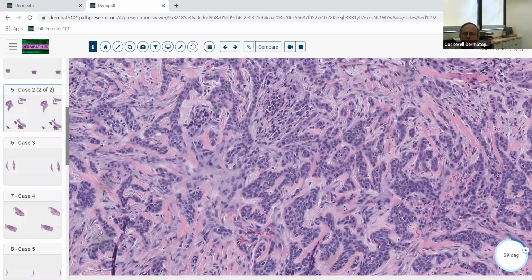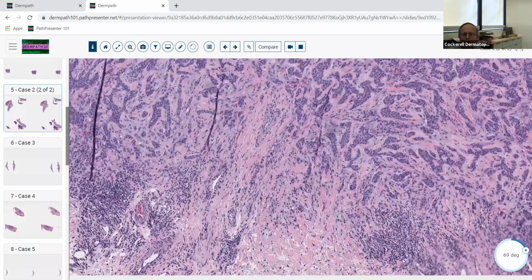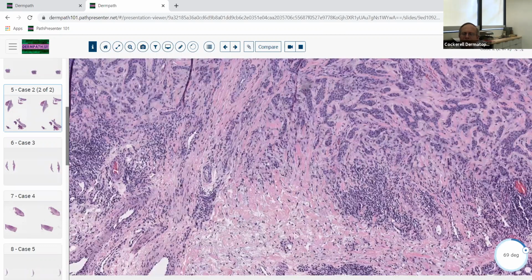We really get more concerned when we look down at the bottom of the specimen and see a relatively large nerve twig. We don't have any of those here. That's got evidence of squamous cell carcinoma that's in what looks like the perineurium. And that's really a sign, a manifestation of a metastasis. It means that those cells are getting into that space. It doesn't just necessarily grow like an amoeba. The cells actually break apart. They can float freely.